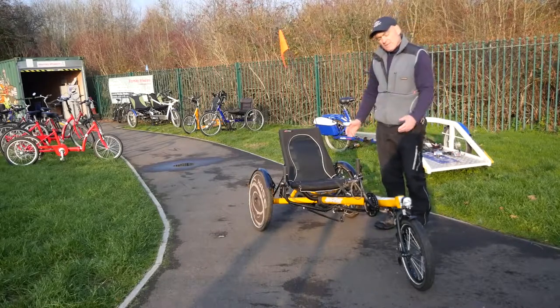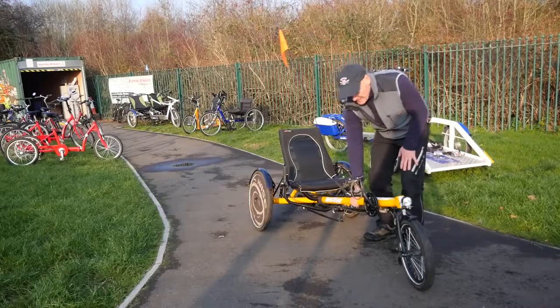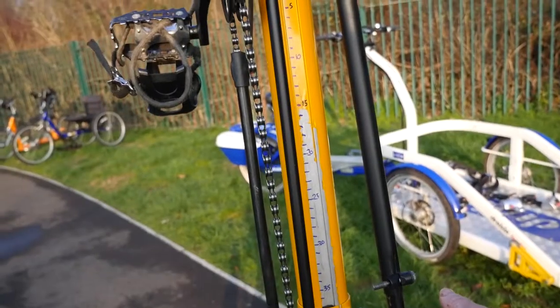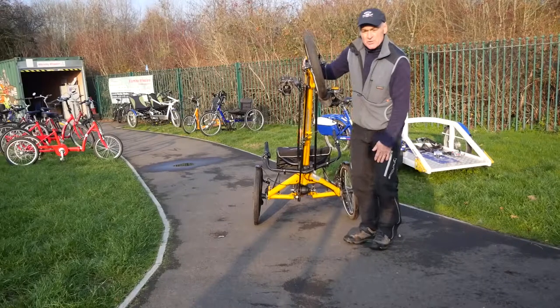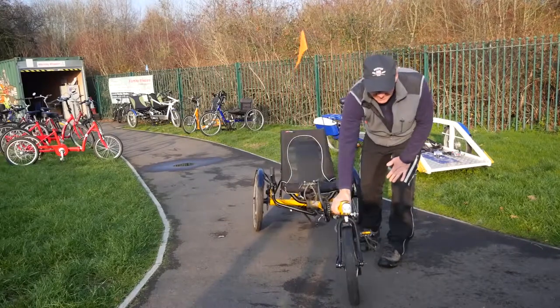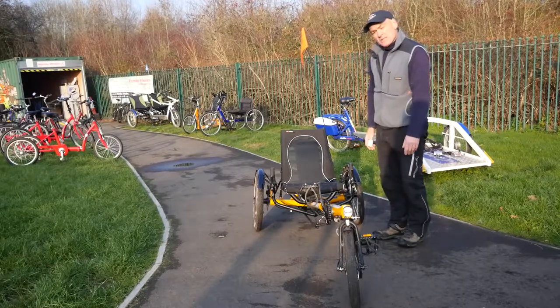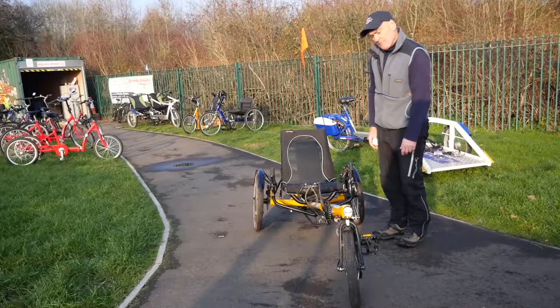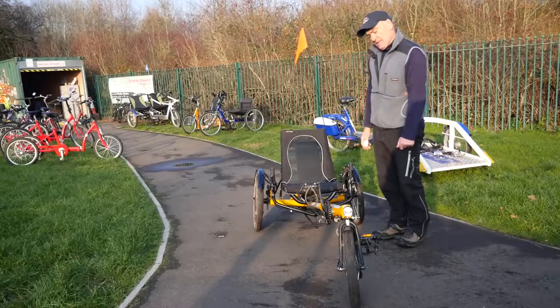It does accommodate people of different heights — this central pole can be moved up and down. If I lift this up you can see there's some calibration markings, which means once it's been set up for you — usually a trial of two sessions — we've got a calibration that's perfect for you. To recap: the service user needs to be fairly independent and able, because these bikes can go quite quickly, with a carer cycling behind to give verbal guidance.